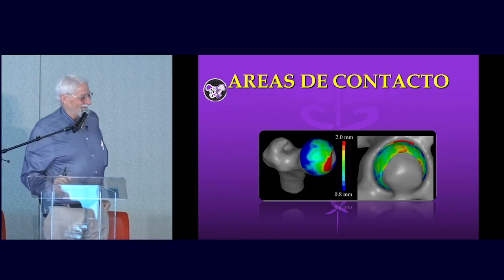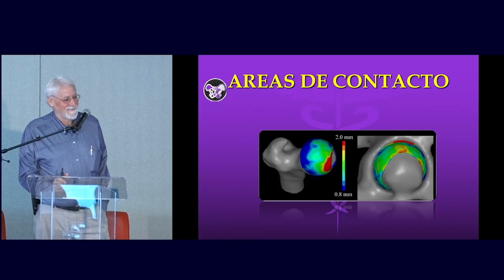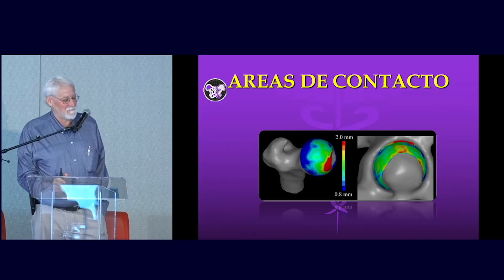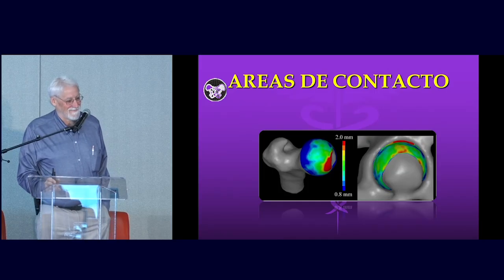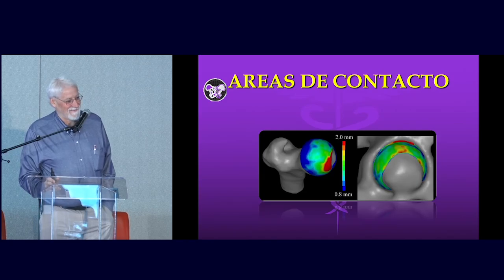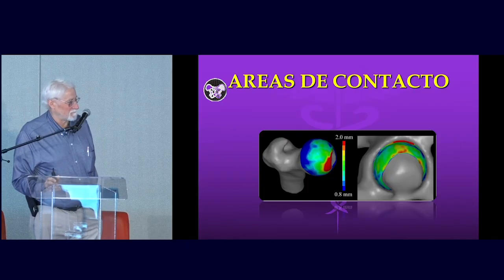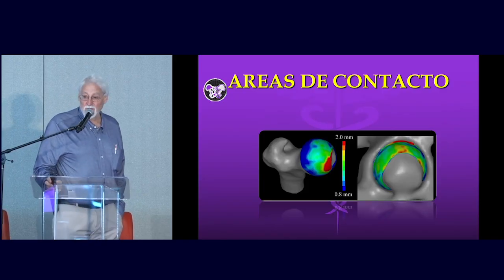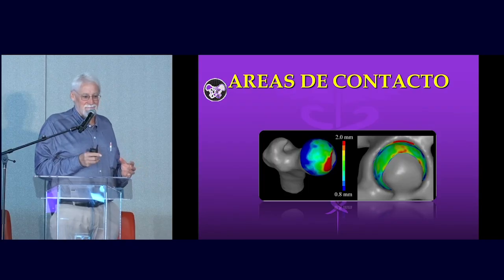I think the simplest way to put it, as I understand it, is that when you load the native hip, what actually happens mechanically is the acetabulum bends around the femoral head. When you break it, it loses that ability to deform, so the contact stresses are different in the joint. When you break it, plate it, and let it heal, that's hard to simulate. We tried to do it with some Norian stuff, and it suggested if you put grout in there, it's a little better, which would suggest if it heals, it might come back to normal. So we don't know, but to me, I thought it was fascinating. He perfectly reduced it, and it still wasn't the same.